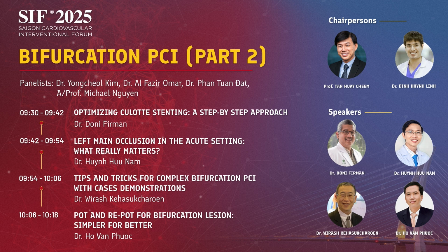Okay, fantastic passion there about this. Maybe the hands in the audience, who thinks POT is very, very important? Like any intervention to the side branch, you should always POT at the end. Yeah?